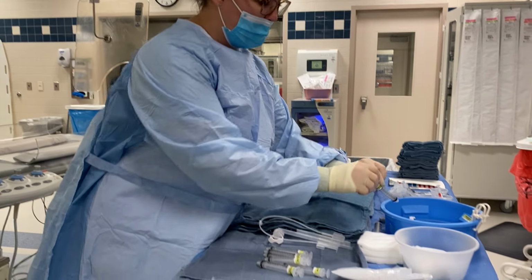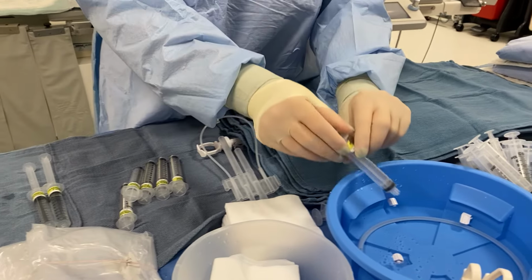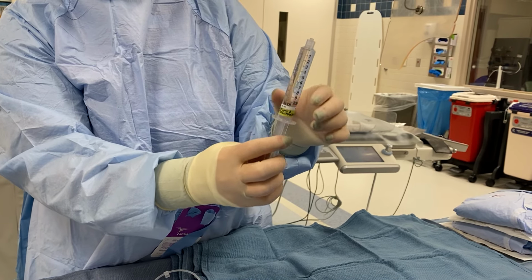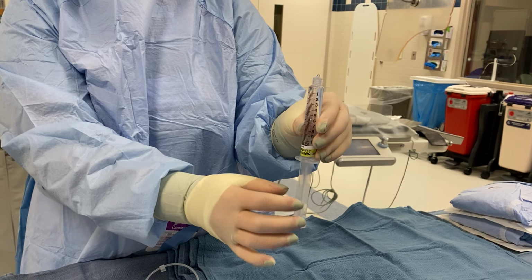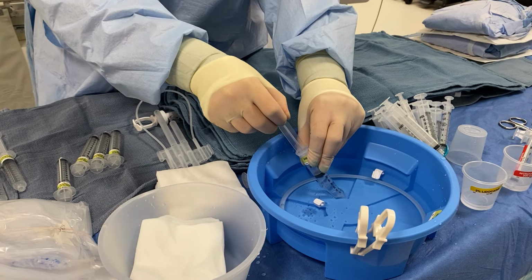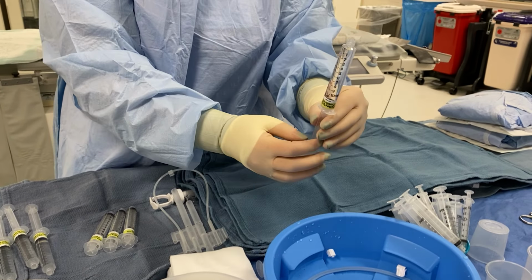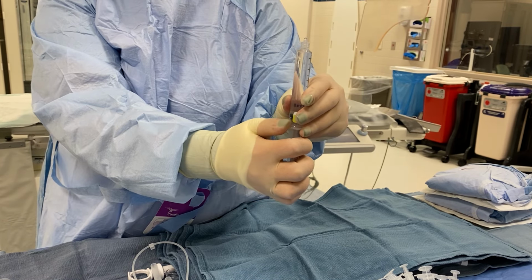And then I like to have all of my syringes filled and prepared. So I'm just drawing everything up. And when you're drawing up your syringes, you wanna make sure that you have no air. So you always wanna give it a little tap and push out to make all the air go to the top, and then just push out the air. Just little drips. So that one had a little bit of air in it, so I'm just gonna give it a tap and push it all out.